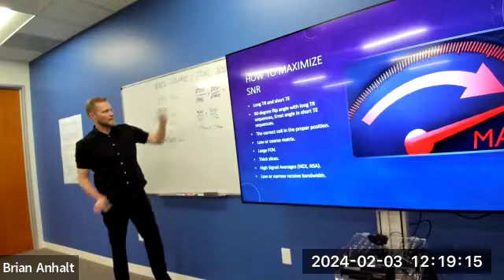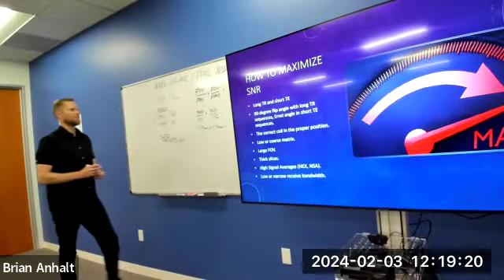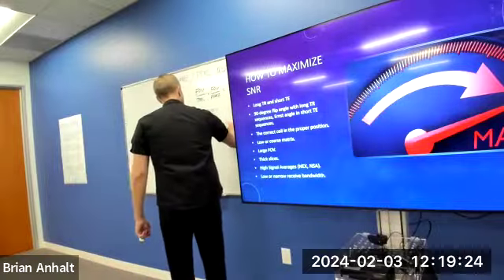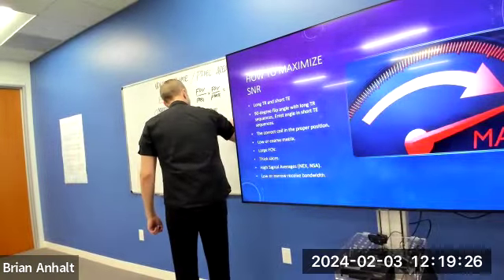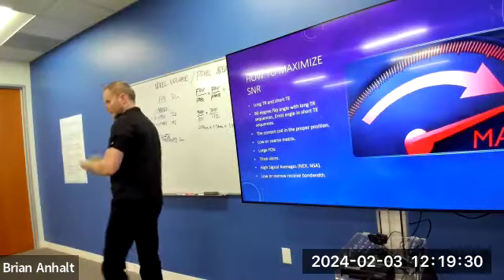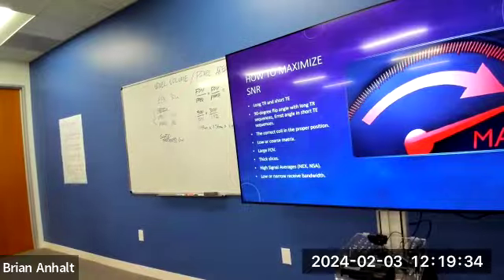To figure out pixel area, we just multiply those two numbers together. What do we get? 1.45? That is 1.45. Thank you for doing the math for me. And it's millimeters squared, right? Because we're looking at little squares or rectangles in this case.